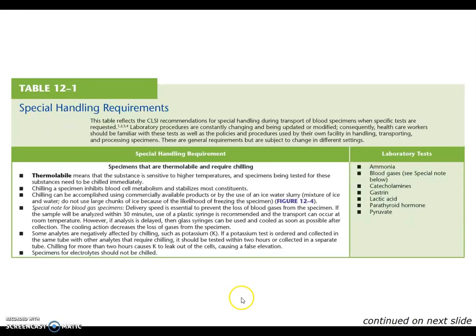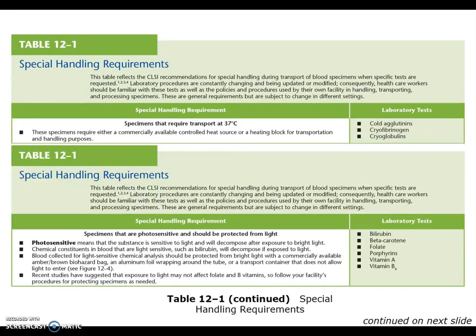Please be aware these are some of the common lab tests that require us to have a chilling mechanism in place. Ammonia is the most common one. Lactic acid is another one. Gastrin is another one that I've commonly seen.